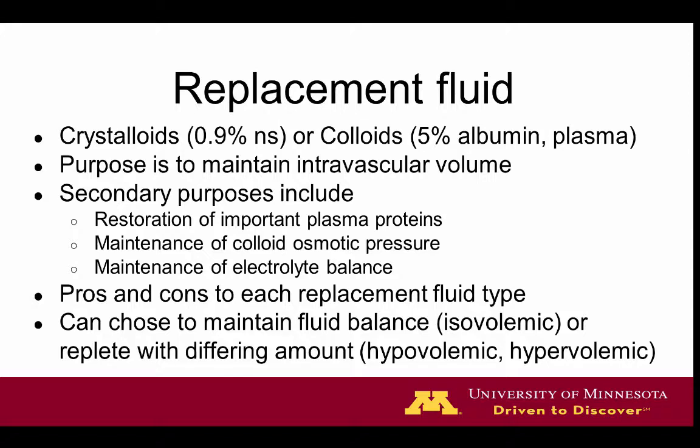And specifically with the procedure, although I mentioned that the purpose is to maintain intravascular volume, you can also secondarily do other functions such as repleting the patient to maintain their fluid balance, or to decrease their fluid balance or increase their fluid balance, depending on whether they start out as hypo or hypervolemic.